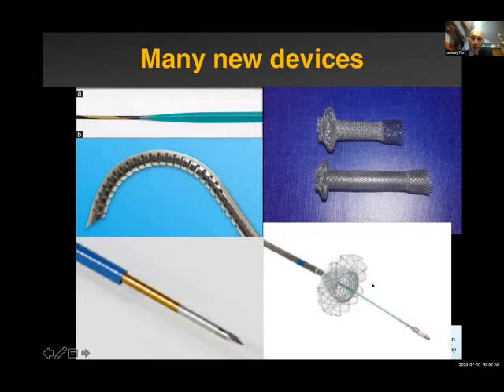These are the cautery enhanced delivery systems. This is a hot Spaxus, which has come out as well. This is an Axios hepaticogastrostomy or CDS stent. You can see the trademark Axios dumbbell on one side, and the other side is a covered to uncovered metal stent, again designed for use in HGS or CDS.